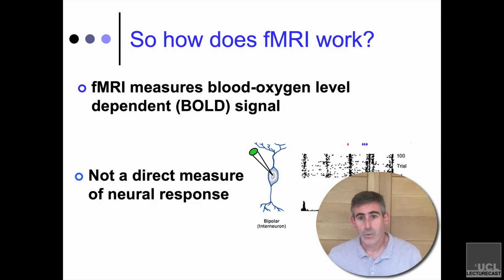But what we're interested in is functional magnetic resonance imaging, or fMRI, because we want to know not just what the tissue is, but how it's actually being used. And that depends on something called the blood oxygen level dependent signal, or the BOLD signal. And the clue here is in the name. What we're interested in is how blood oxygen changes the signal that we're actually measuring.